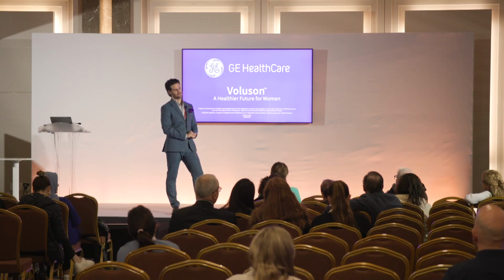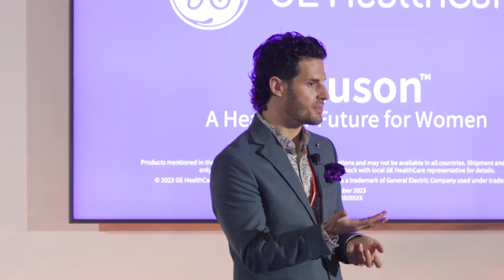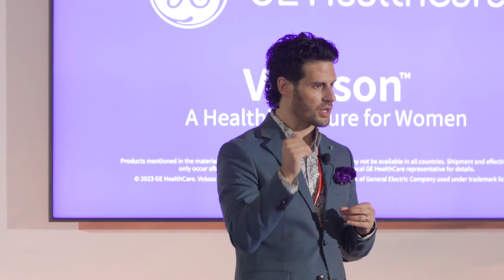Matthew, what about the setting, probe, duration of the scan, more or less? There is information about that. The duration of the scan when you're looking for superficial endometriosis primarily is actually shorter because there's no deep endometriosis. If you've already evaluated the deep endometriosis, you're probably not caring so much about the superficial in a really critical fashion. So you can rule out bowel nodule quickly, USL nodule quickly, and then you go straight to the pouch. So it's actually a shorter scan when everything is normal and you're just looking for superficial.